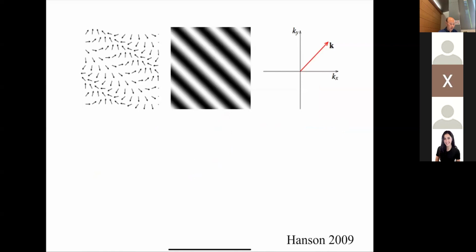Okay. So this is just reminding us, so far we've talked about being at some point in K-space, and it corresponds to some pattern like this, right? But this is sort of simplifying the view. What we really want to do is go from this simplified view of just stripes to this view here, which is really what the complex exponential is, all right? And these are what we're going to get the spins to do.